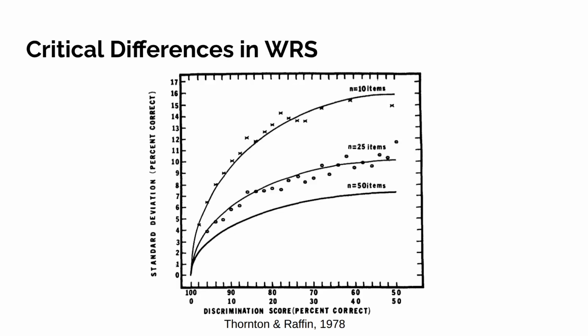The other trend you see on this graph is the fact that you have 0 and 100% located on the left and 50% located on the right. So as we move towards the left, towards 0 and 100%, we have variability decrease. We can see it go down.